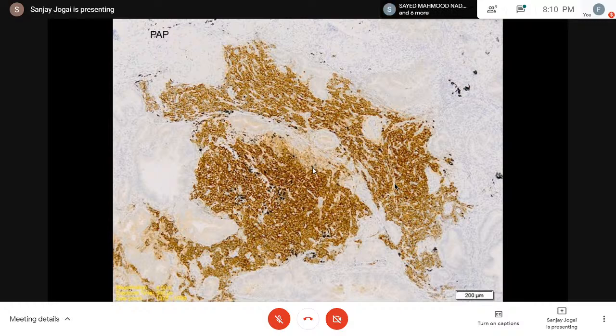I have posed these questions to people like Andrew Nicholson at Brompton and John Gosney in Liverpool, and they said the same thing. They said in most of the situations, TTF1 sorts it out. So that was the reason I was saying people are not big fans of napsin. But in America, a lot of people use napsin.